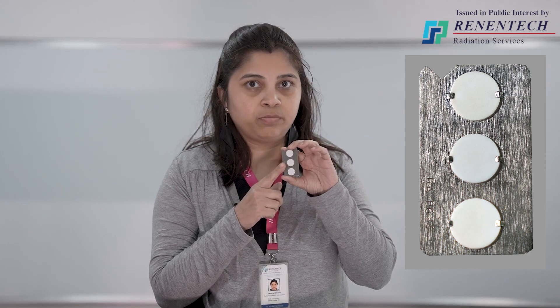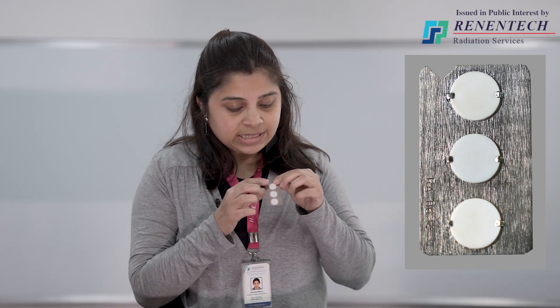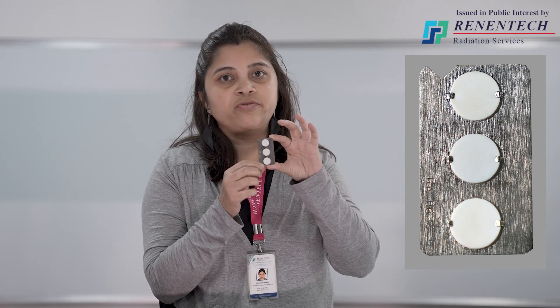How does the TLD badge assembly look like? Many people are curious about what is inside the black color pouch. Since we send the TLD cards inserted into the black color pouch, out of curiosity they just cut and open the pouch to see what is inside. So now no need to do that — I will be showing you the whole assembly. This is the bare TLD card which is inside the black color pouch. It has three discs and these three discs play an important role in dose evaluation.